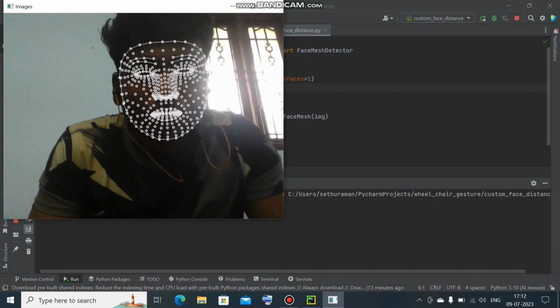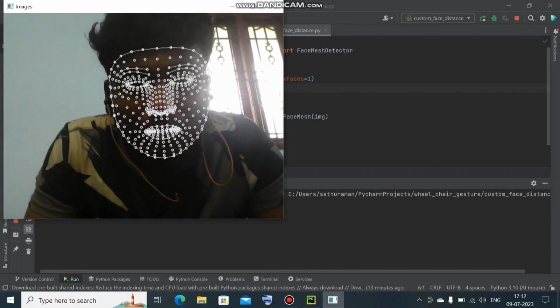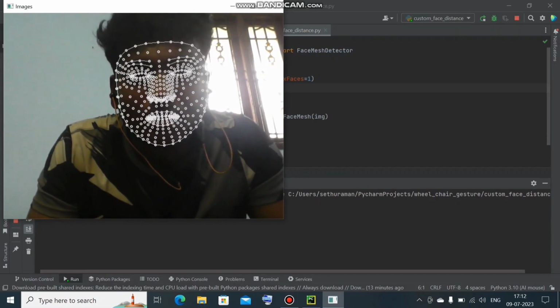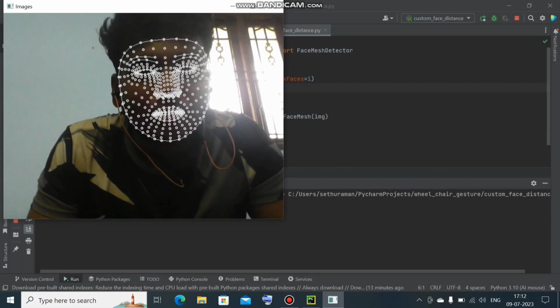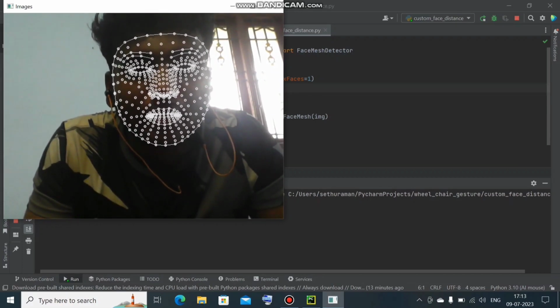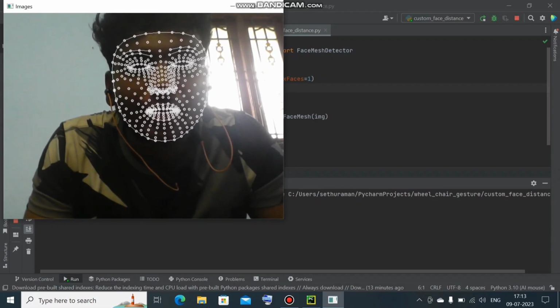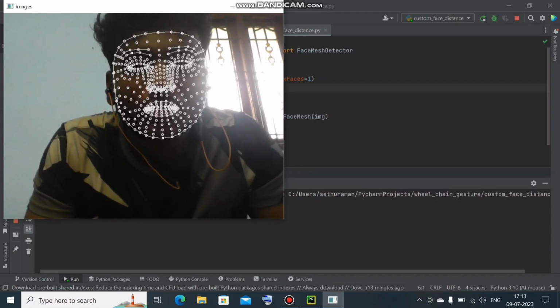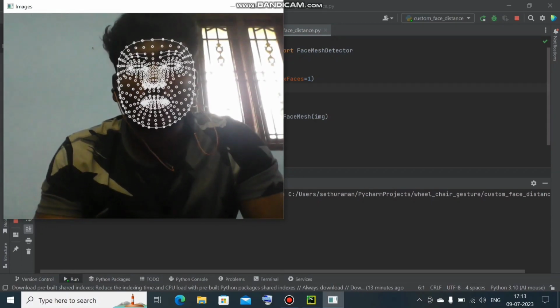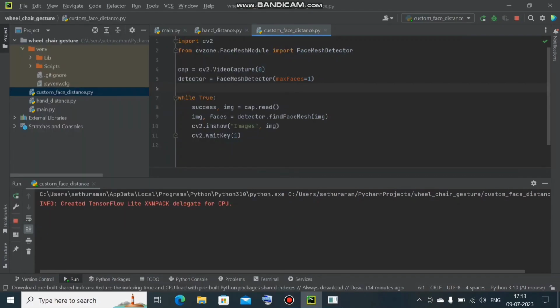So now my aim is to find the landmark list. I guess the cursor will not be visible in the screen recording, but just to see, in my left eye and in my right eye there will be a point. I need to find the midpoint of both eyes, and I am going to draw a line so that I can find the distance between them. So let us do that now.